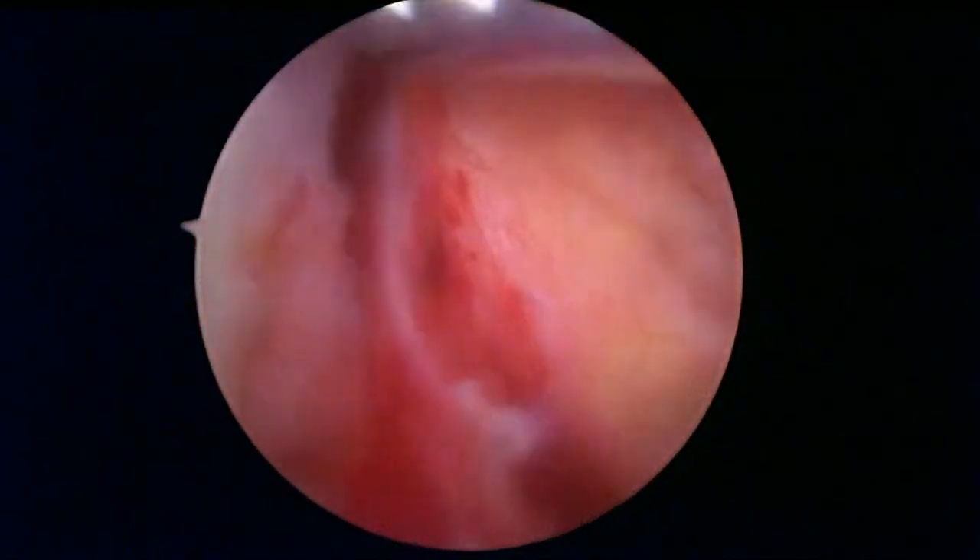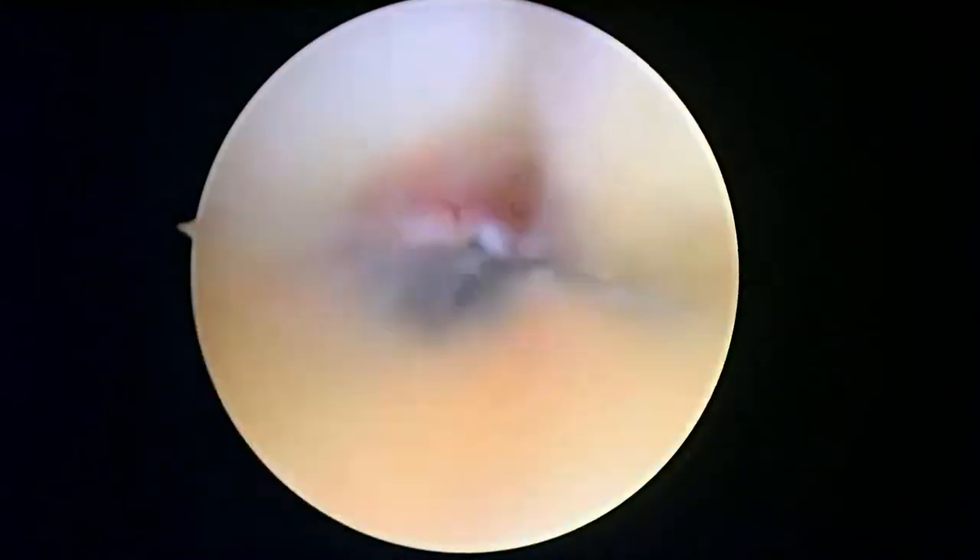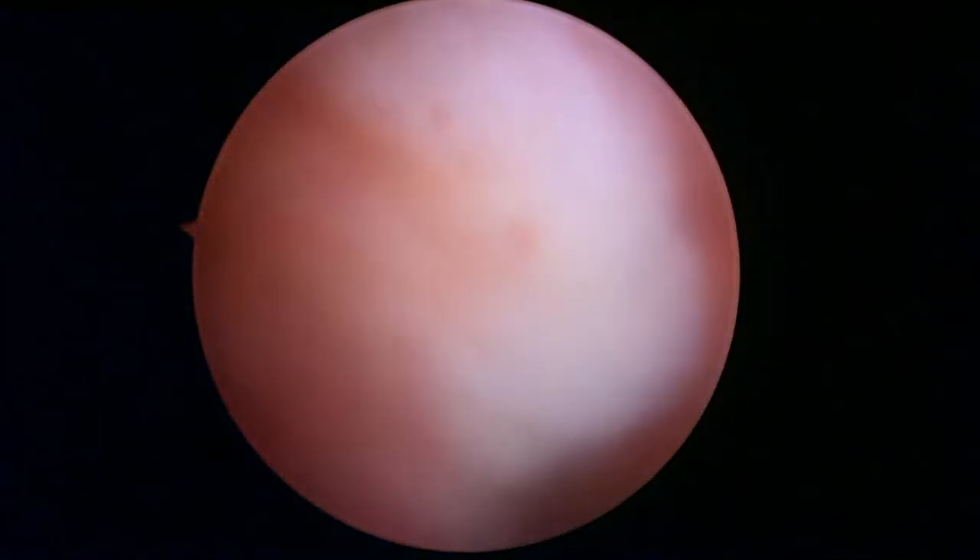Now we're getting ready to look in the middle part of the knee. The most remarkable thing is there's a lot of inflammation in the knee — this fat pad here is pretty inflamed and very vascular. We're going to take a look and determine the condition of the ACL and PCL ligaments. First we're going to get a little bit of hemostasis here.